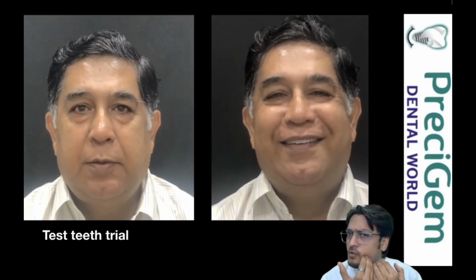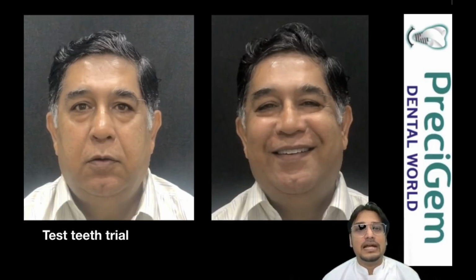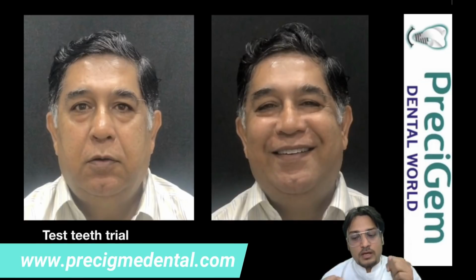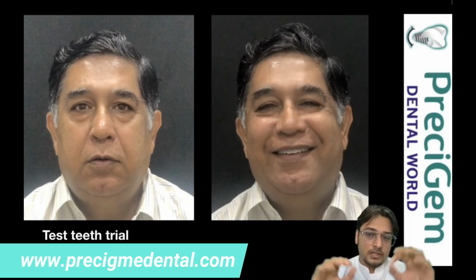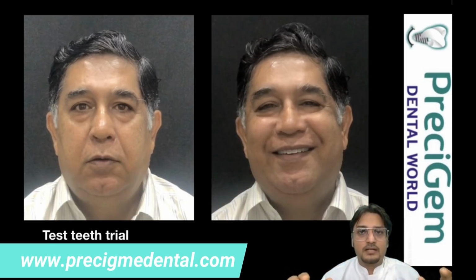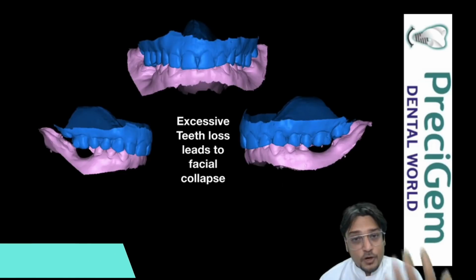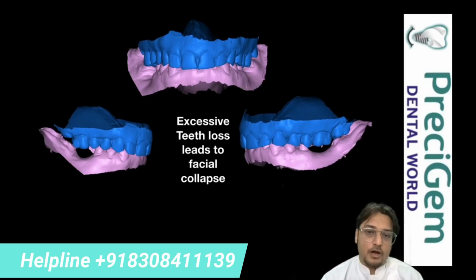Here, my friend, nothing is done right now to the lower teeth. That's the second step, which we call functional. Functional means now your chewing will come into consideration. Here in the first step we will just check how the smile is looking. In step number 2 we will check how your teeth are going to chew or occlude.